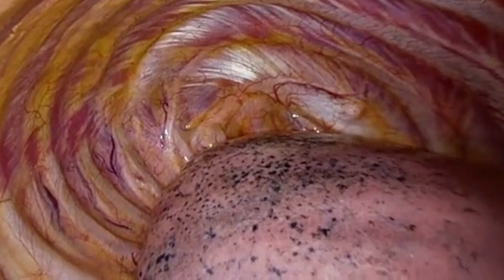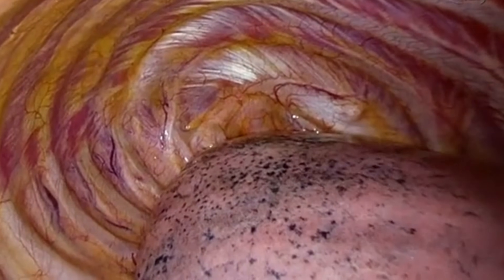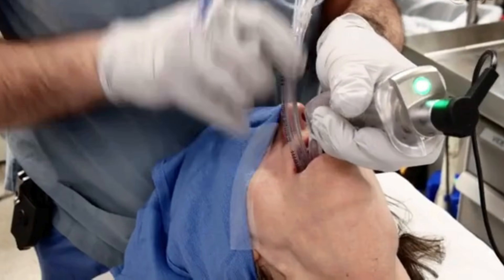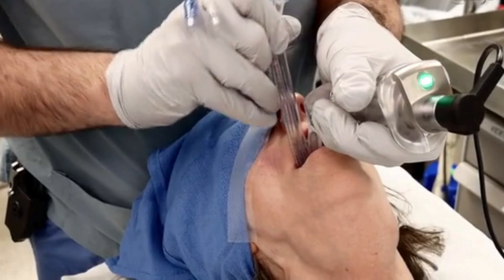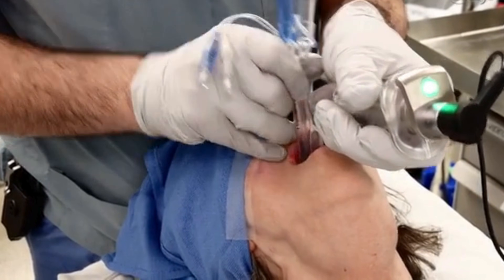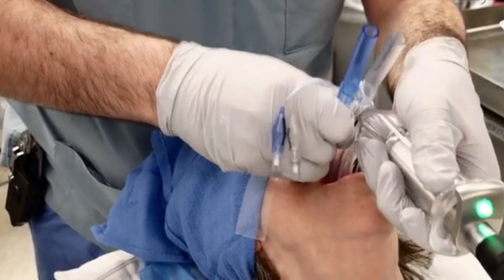In this video, we have reviewed the basics of double lumen endotracheal tubes, including indications and contraindications. We've also demonstrated the technique for insertion and discussed possible complications.